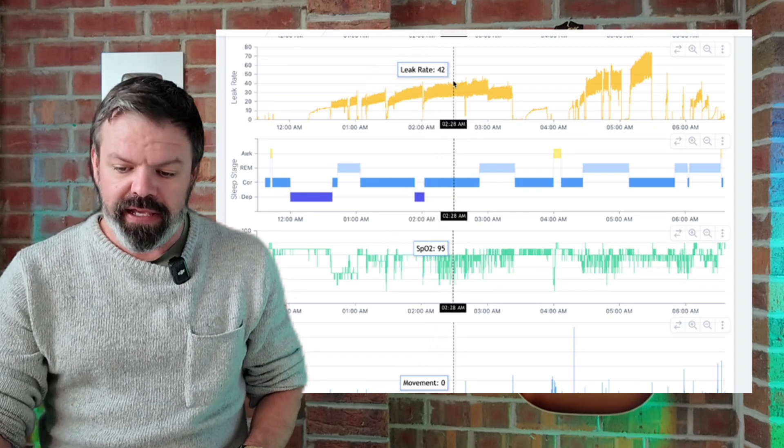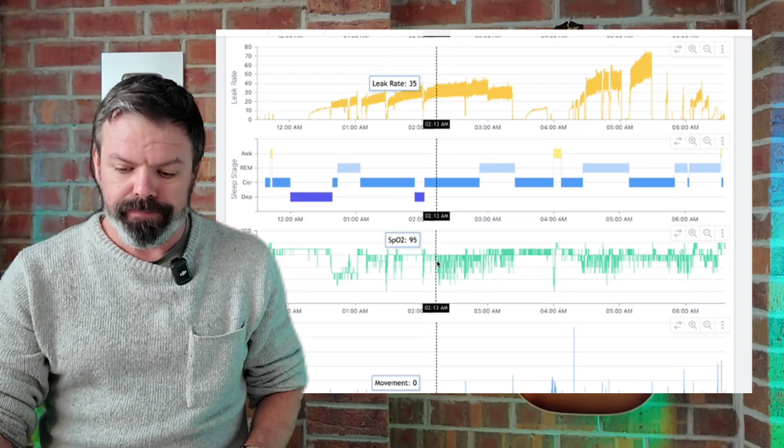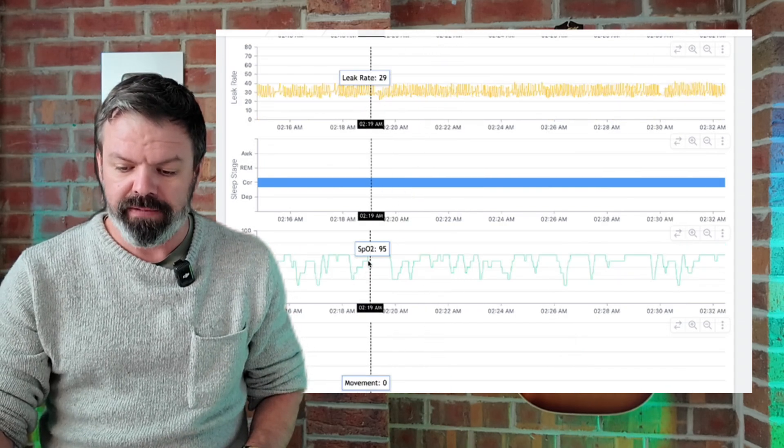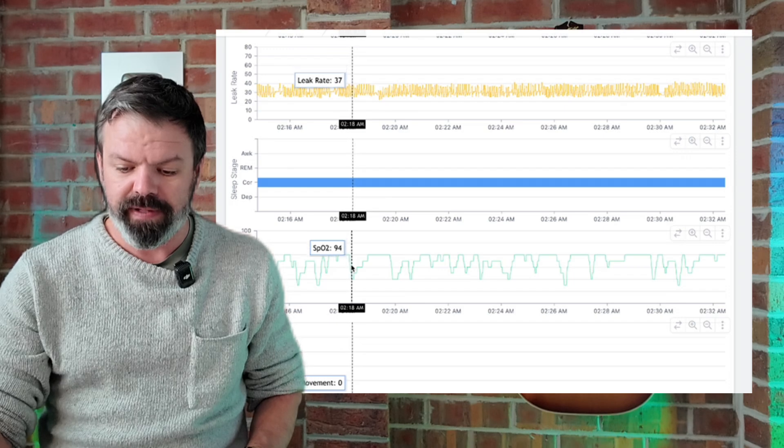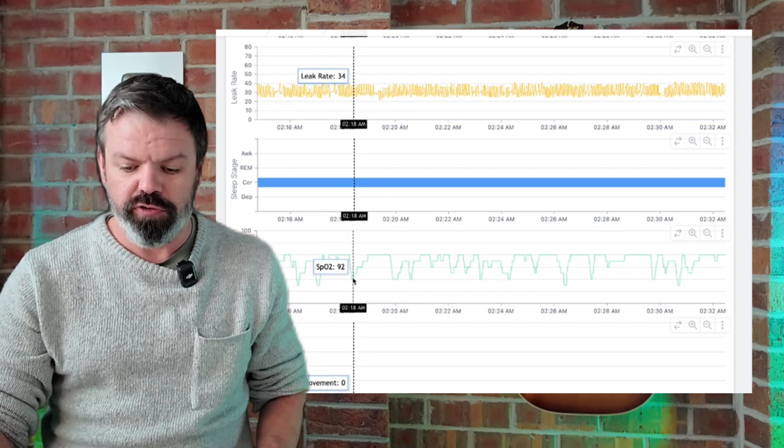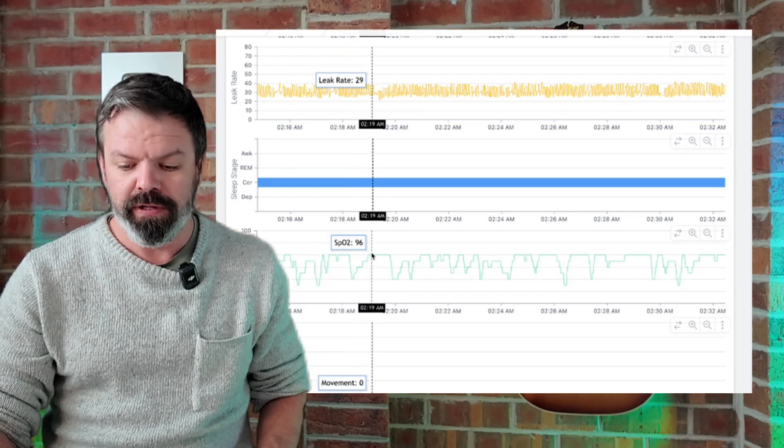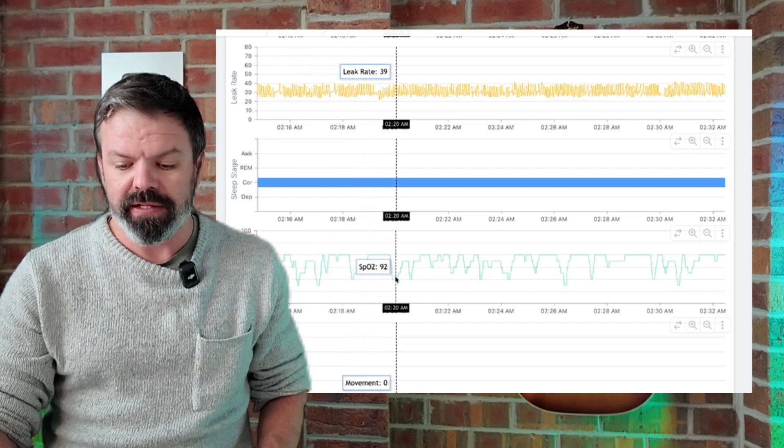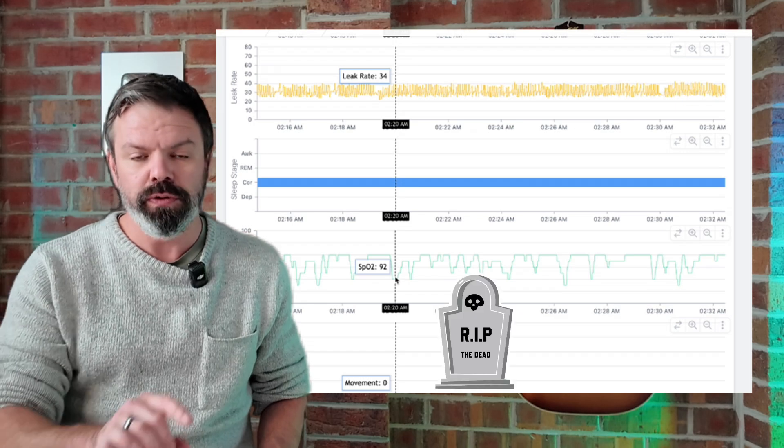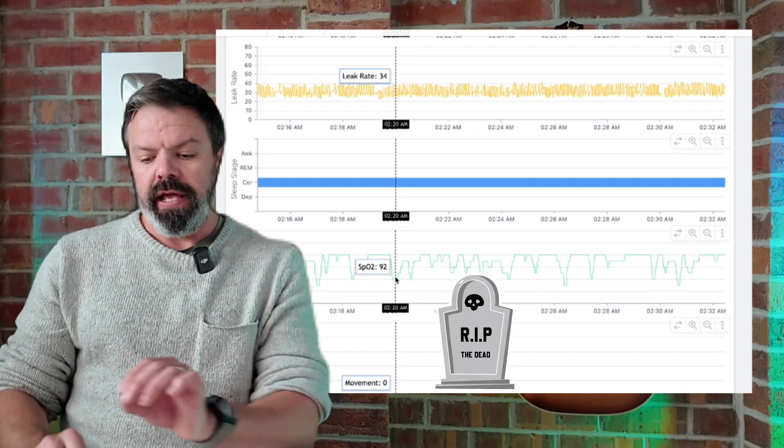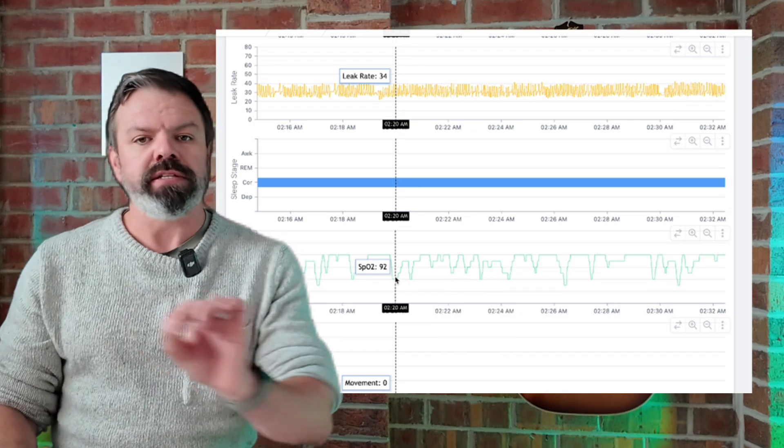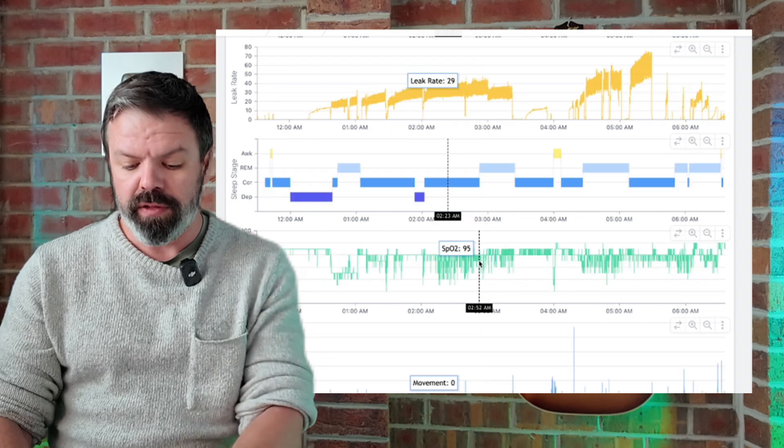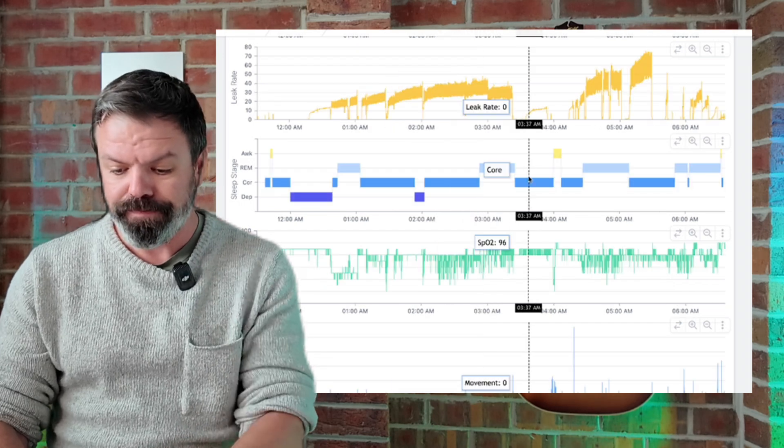But have a look when the leak goes up. Look at it now when I zoom in. See all these drops down to 92, back up again to 96, down to 92. It's no longer nice and stable - look, it's jumping around all over the place.